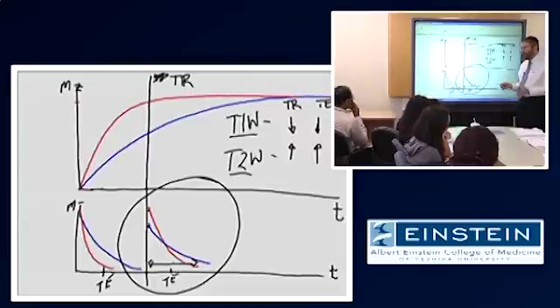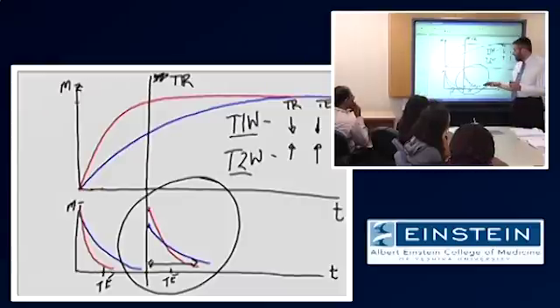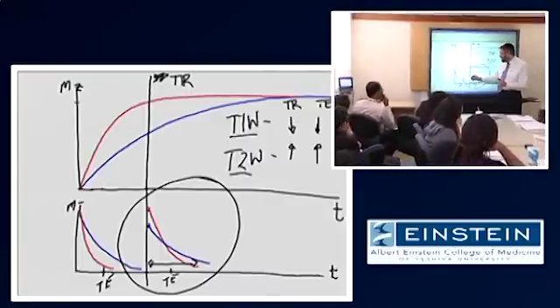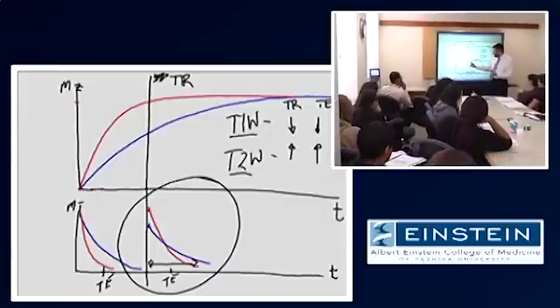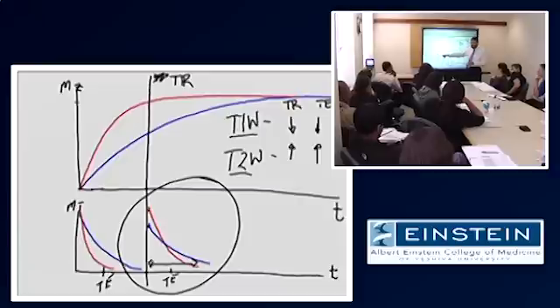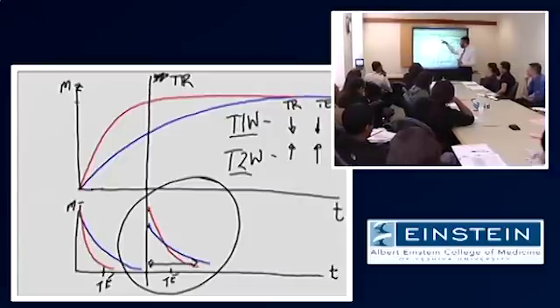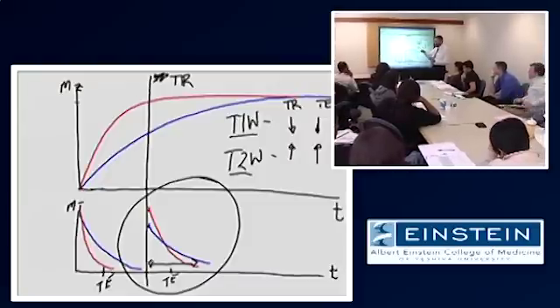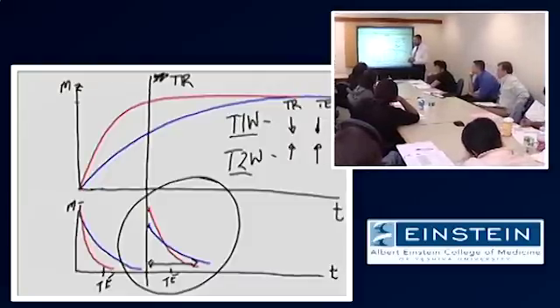Sure. Ultimately, maybe we can diagram an example like that in a minute, but that would definitely weigh into the equation. But my point is, even though that's already involved in the baseline, this difference is a function of whatever this initial baseline is, which is a function of proton density, plus whatever difference you generate by having a short enough TR to pick up those T1 differences. Okay?